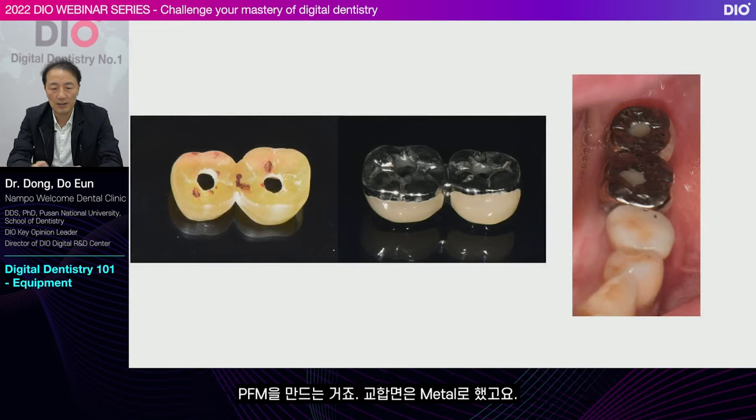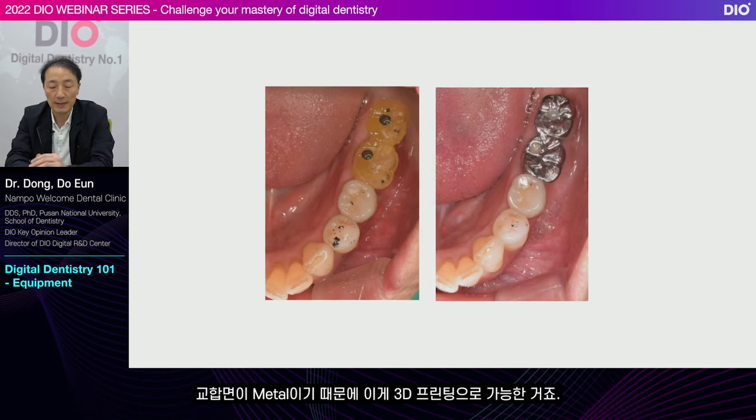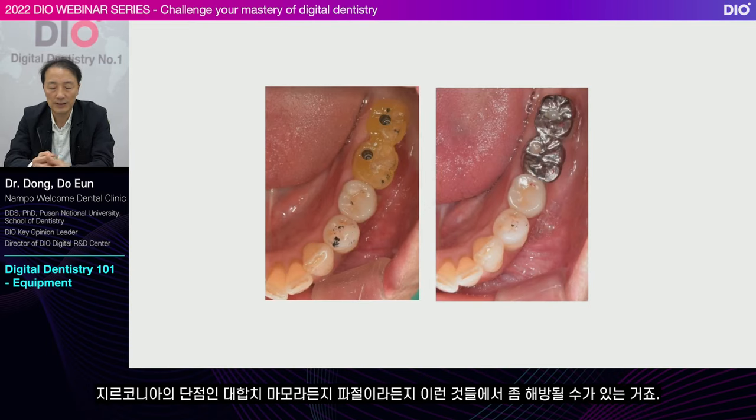I made a PFM. The occlusal surface was made of metal. I attached the face on the side with porcelain. 3D printing is possible since the occlusal surface is metal. The disadvantage of zirconia, such as occlusal abrasion or fractures, can be avoided.